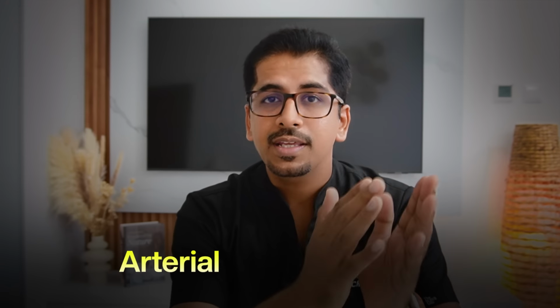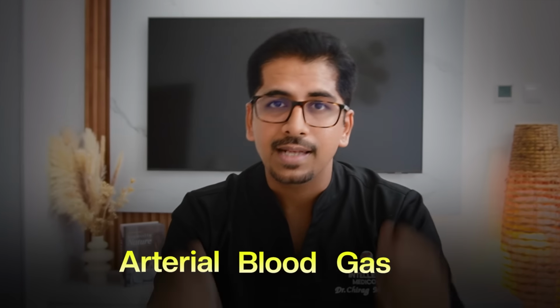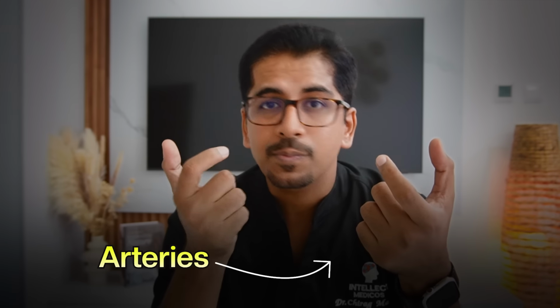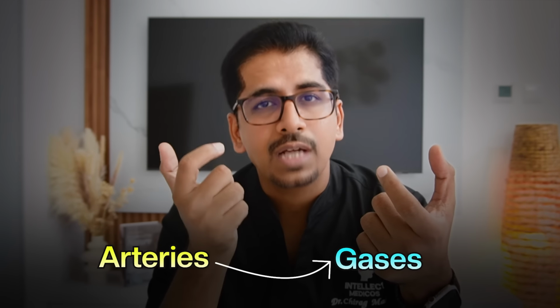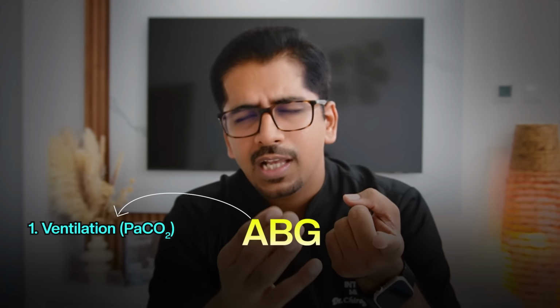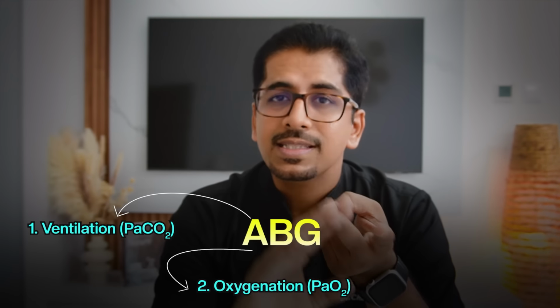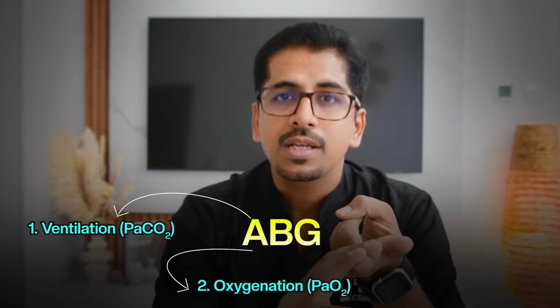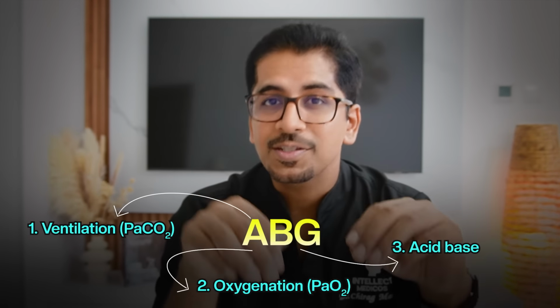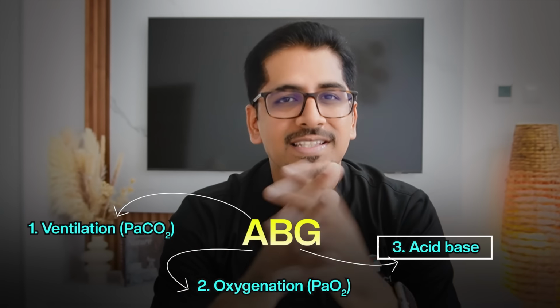ABG is an arterial blood gas analysis in which the sample is taken from arteries, and it tells mainly about the gases, that too carbon dioxide and oxygen. And this ABG tells you about 3 important parameters in a patient. 1, the ventilation status with the help of PaCO2 levels. 2nd, oxygenation status with the help of PaO2 levels. And 3rd is the acid base. And in this video, I'll be talking in detail about the acid base.